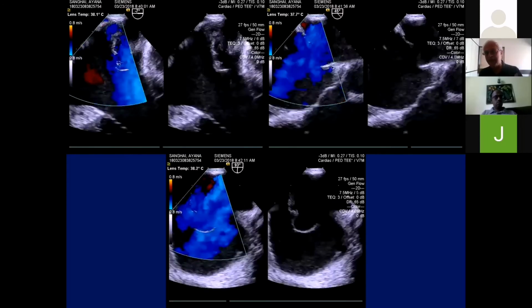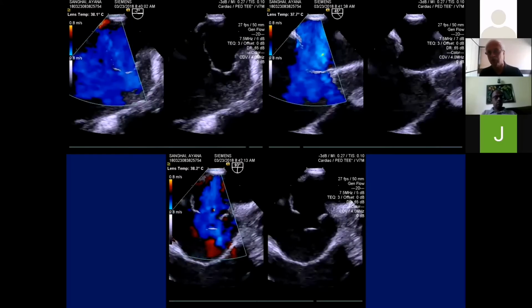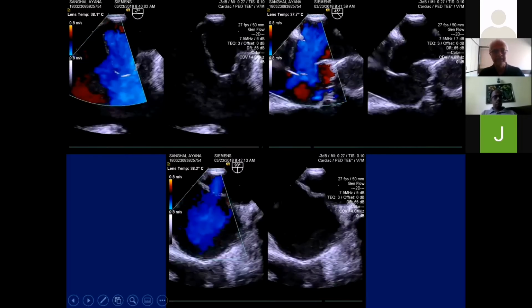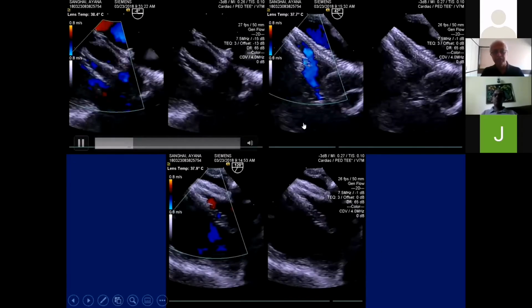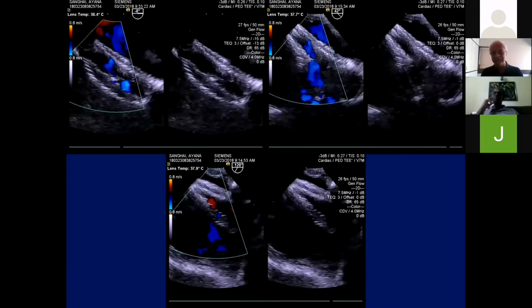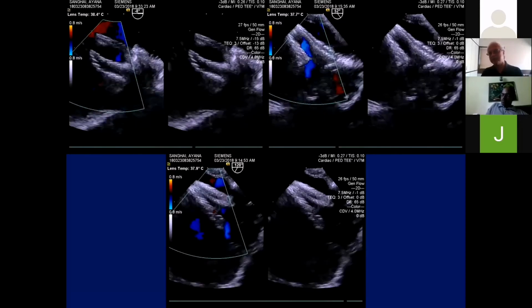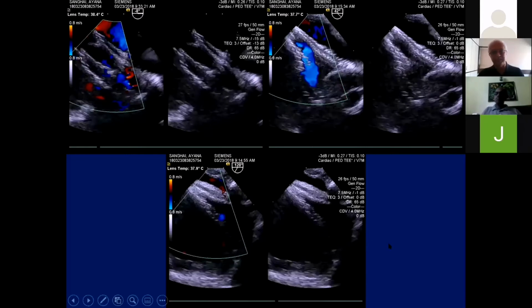The total septal length, I'm not a great believer of that, but when I use Cribriform device, that is the only way you can decide what size device you are going to use, was around 32 millimeters. So we used a 30 millimeters Cribriform device. And you can see how beautifully we have been able to squeeze the aneurysm and close all the defects and look at the stability of the device. It is perfectly stable. So I'm not at all worried about the stability of the device because I have gone through a smaller fenestration in the posterior and inferior part of the septum.